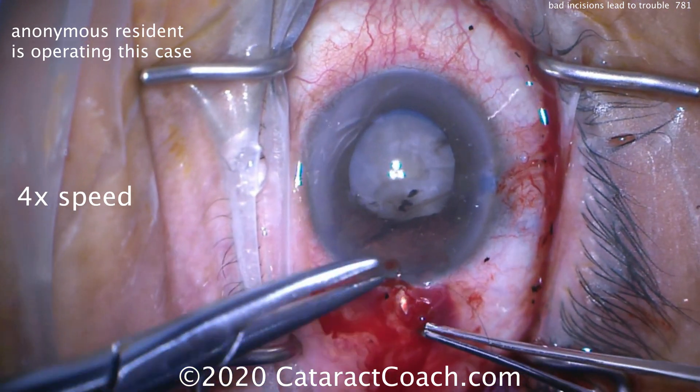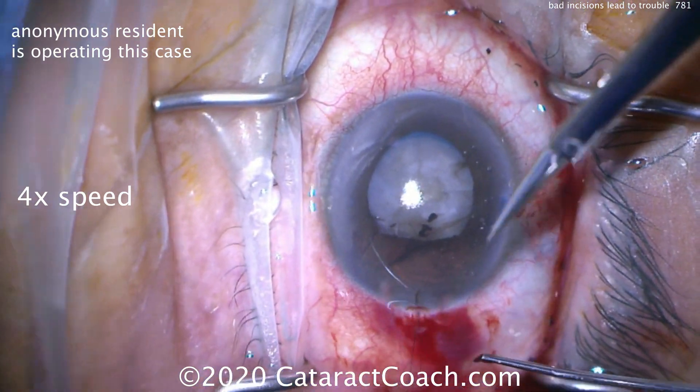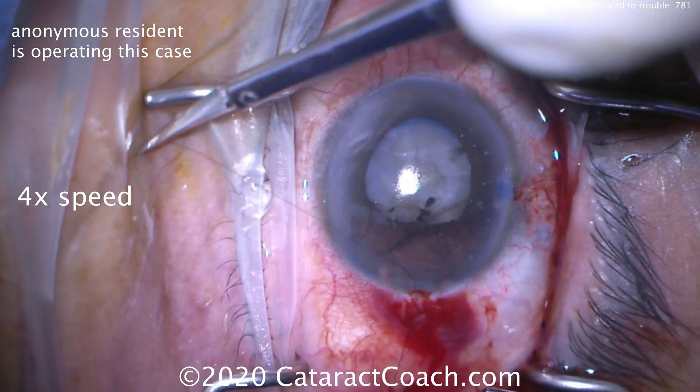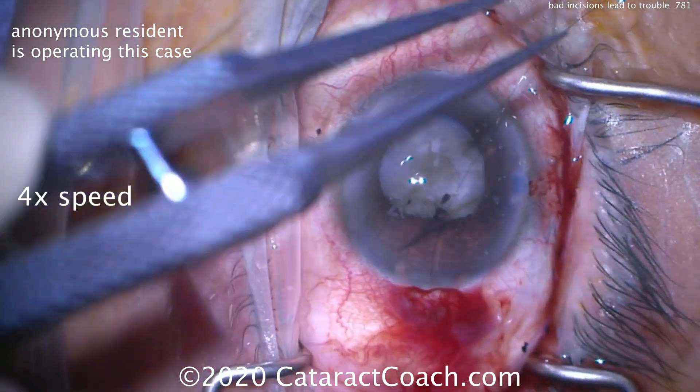The resident is going to get a 10-0 nylon suture and place it here to completely seal that temporal incision. Taking your time, passing the suture, making sure it's a nice good bite with good grab of tissue on both sides of the incision. That suture can then be cut and tied, and we need to make a new incision.